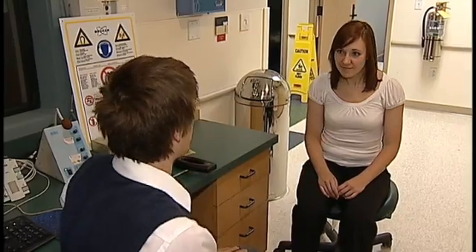This part of the study is optional and a separate sign-up and consent process is involved. After arrival at the scanner and consent, participants go through a safety check. If this is their first scan, participants are often anxious about entering the magnet. While safety is the primary concern, some care needs to be taken to not alarm the participant and to reassure them that there is very little danger involved, provided they pass the safety check and do not bring any loose metallic objects into the room.